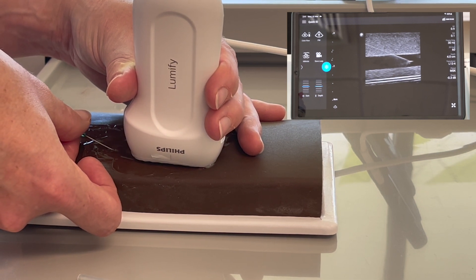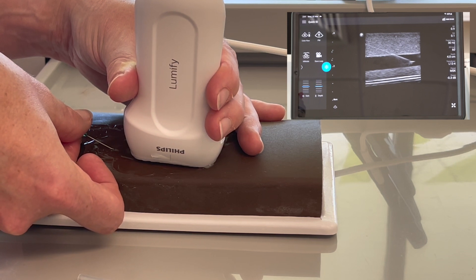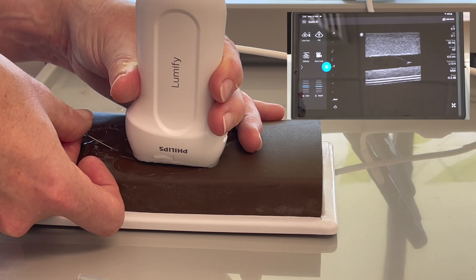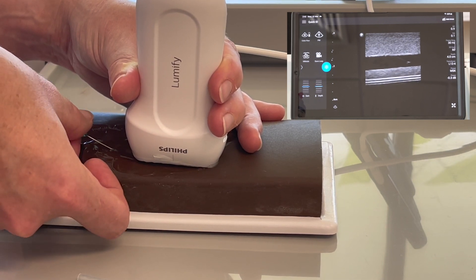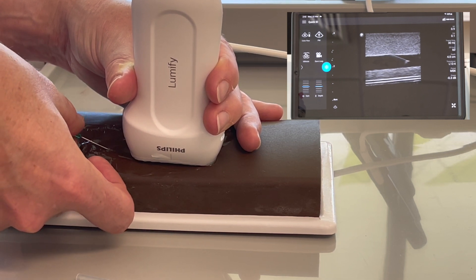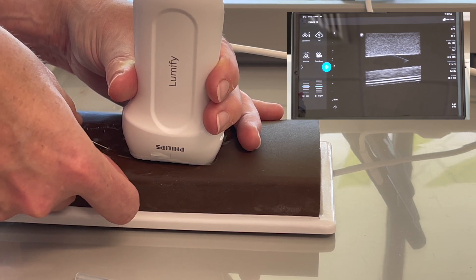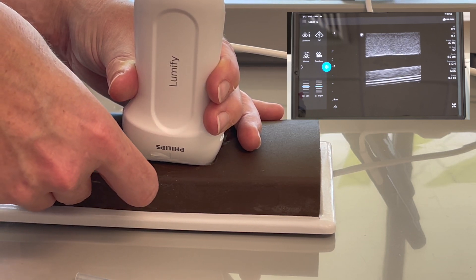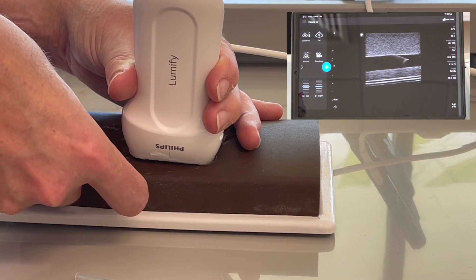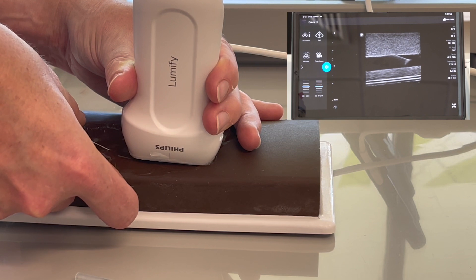The disadvantages of this view are that you can't see surrounding structures, so you don't know if you've accidentally slid into an artery or slid off your target vessel. But it does give you a really nice view of the whole needle. If you don't have your needle directly under your ultrasound beam, then you lose it. It's about lining up your ultrasound beam with your needle tip and keeping your vessel walls nice and defined.